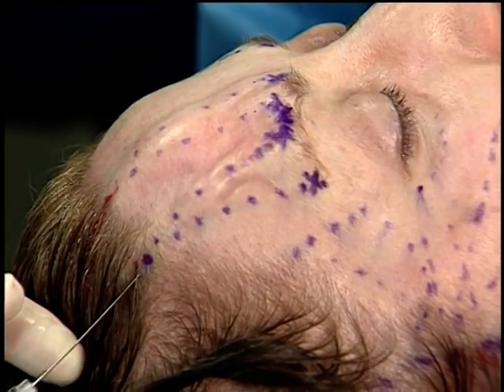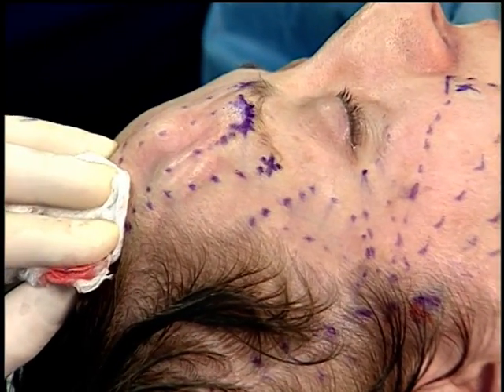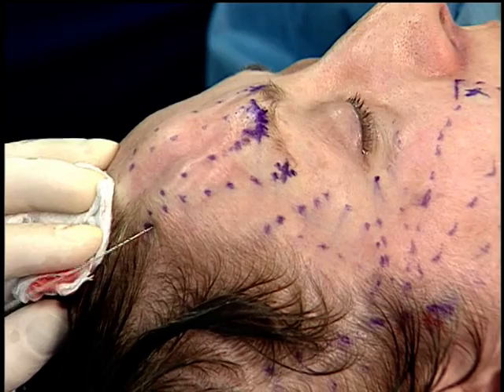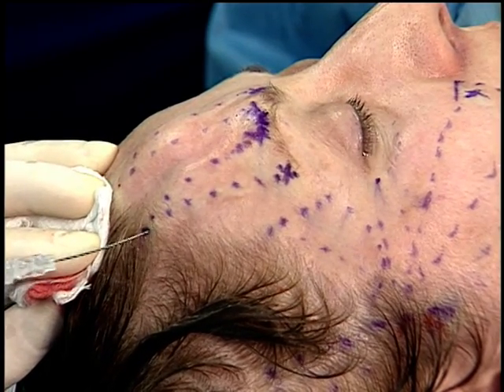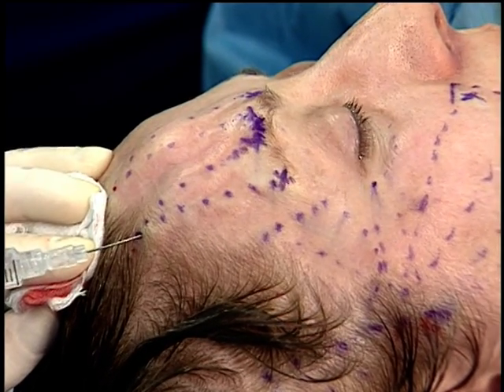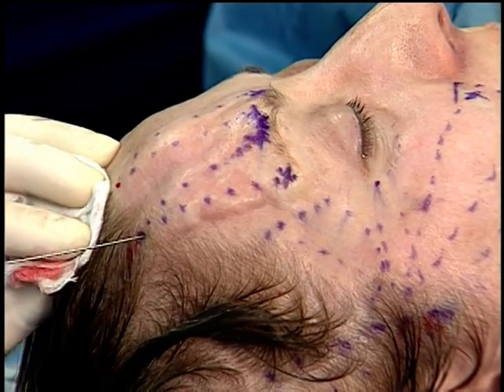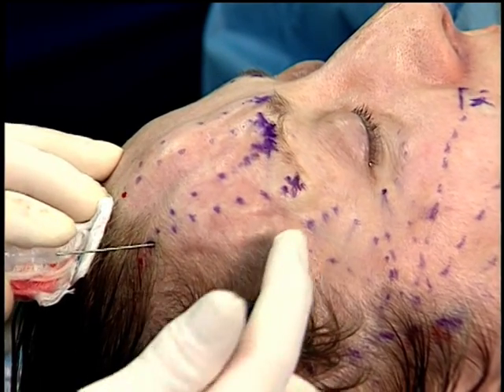The reason I use 5 cc syringes, given my surgical mentality, is that if you give me 10 cc's, I'll use it up quickly. 5 cc's forces me to try and use just 2.5 cc's per tunnel. So a little more control. Slow hydrodissection, slow hydrodissection. Small amount injected before I advance the needle, and then withdraw and inject your 2.5 cc's on the way back.